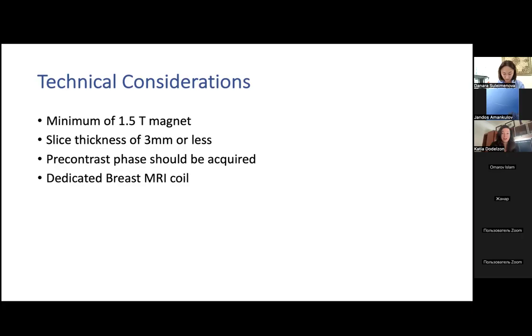In fact, right now, just as an aside, there is an investigational study looking at a supine breast coil from GE. So one where patients could be lying down on their backs. It's still in investigation. We're working on it with GE at Cornell, just so you know. Eventually, it'll probably come to fruition, but right now, all of them are prone.